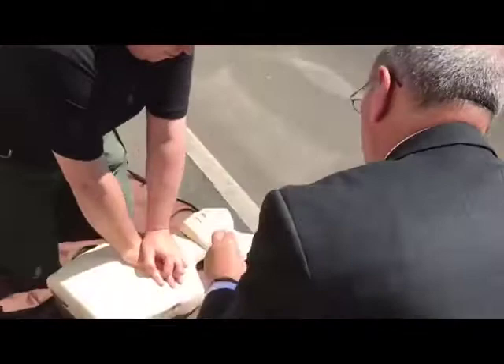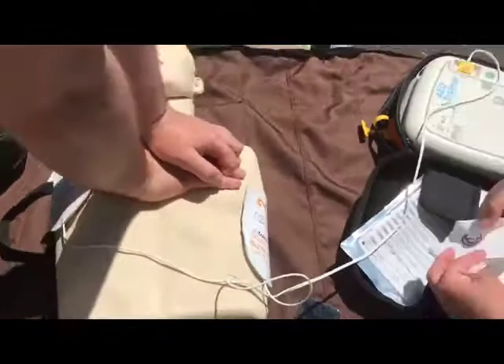Peel off the pad labelled one and pop it on the top right of the chest. Peel off the pad labelled two and stick it to the bare skin of the patient — down here under the left breast. Push the pads firmly to the bare skin of the patient.